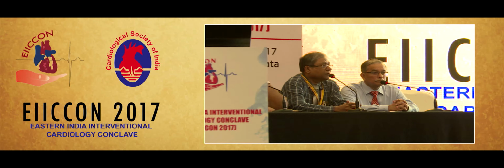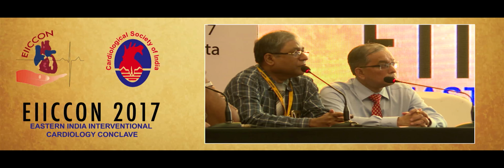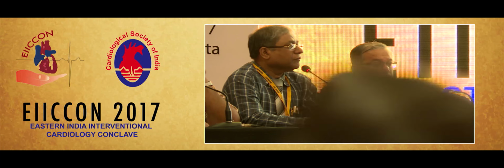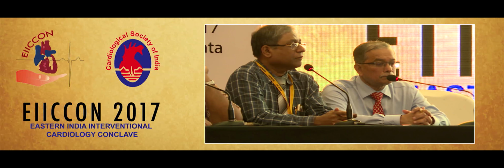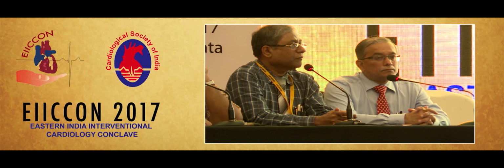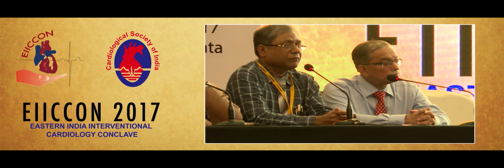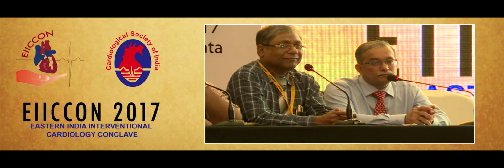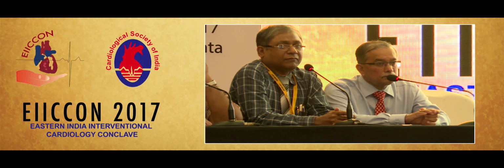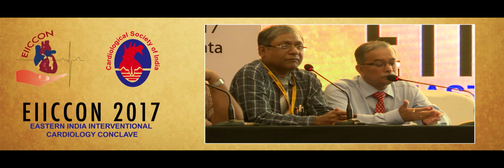So one suggestion: the stent balloon is compliant or mostly semi-compliant. If we pull the stent balloon back into the proximal part and go at high pressure, 18 or 20 atmospheres, does it make some degree of POT? We can call it a poor man's POT, because you're trying to use the same balloon, but I don't think it will give you the same feeling that you would get with a non-compliant balloon. Maybe to some extent, yes, but not the same.